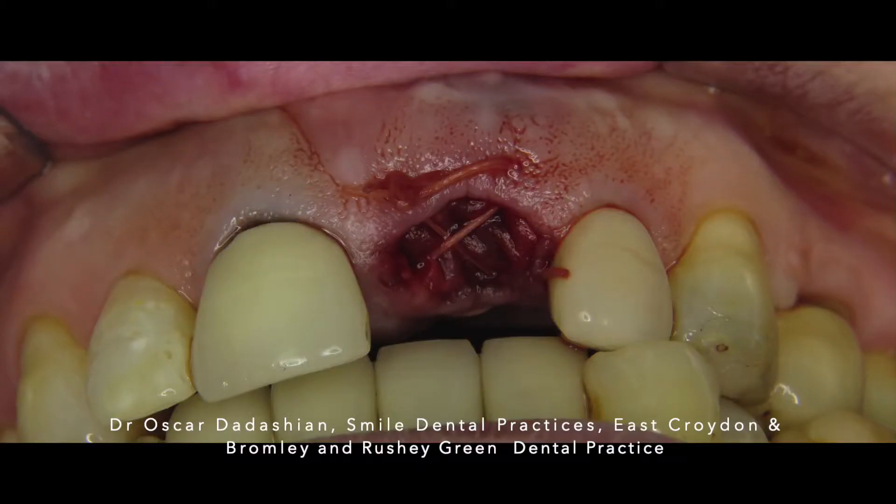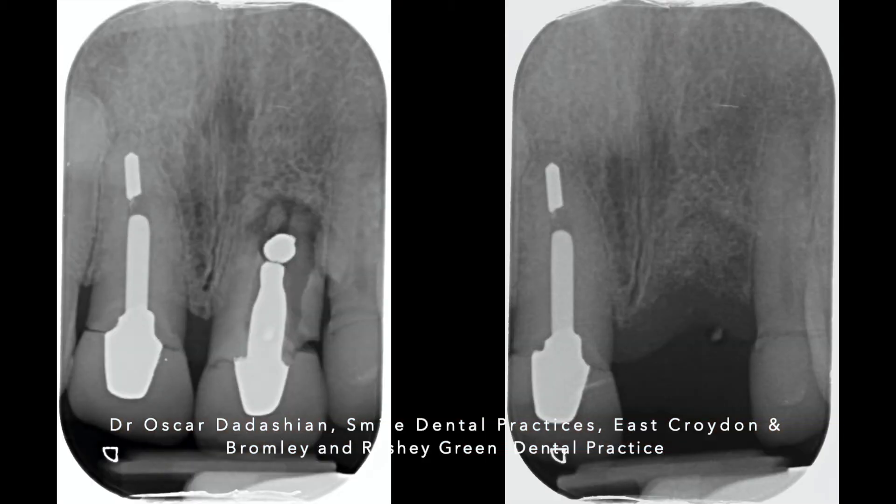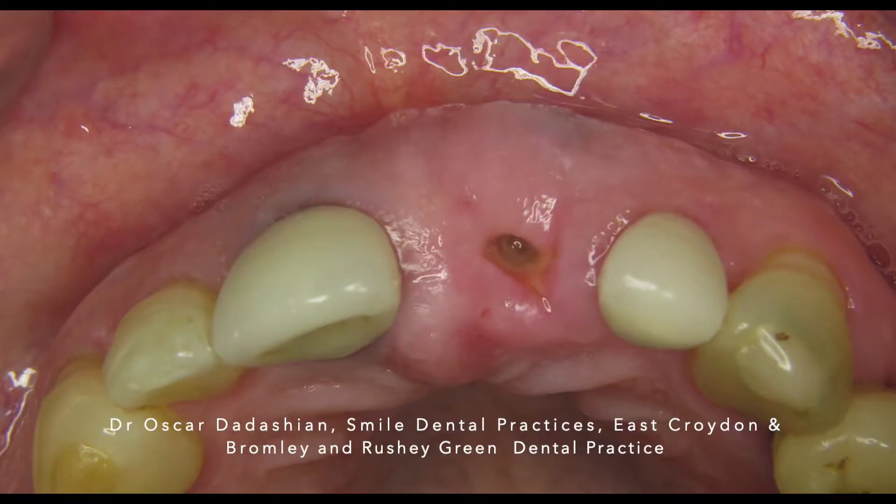In this case we performed socket preservation using a collagenated xenograft and covered it with a porcine membrane. By doing so, we have repaired and restored the distal bony peak. You can see the before extraction and socket preservation on the left and the results of the socket preservation on the right — this is one week after the extraction.